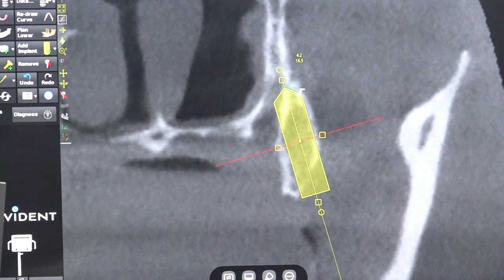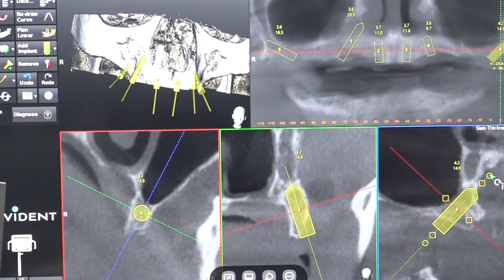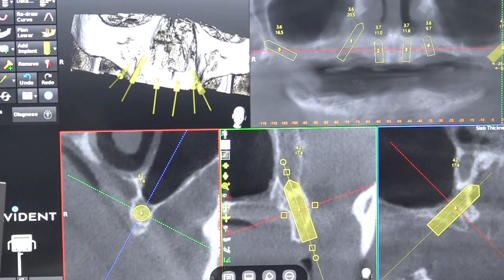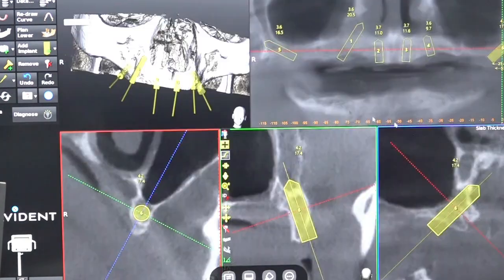In case during surgery unknowingly if you enter this space, that is not a worry. Select a shorter implant, and the moment you place the implant, the bleeding will stop. So better to take an IOPA during the drilling stage and engage the correct part. The higher we are engaging, the more risk of the descending palatine. So this will be a correct angle which we can confirm during the drilling. So on the left side, the descending palatine is not a major challenge.